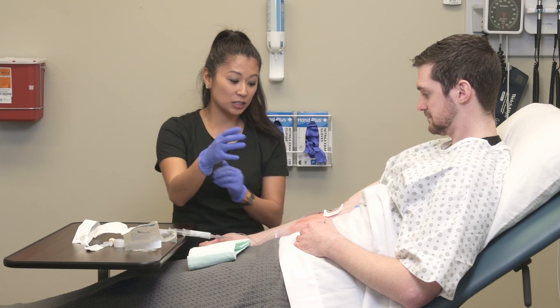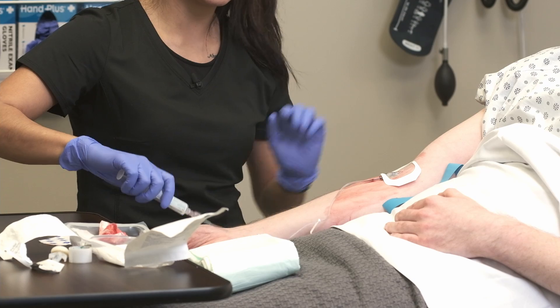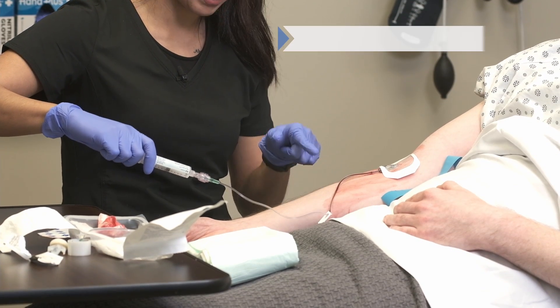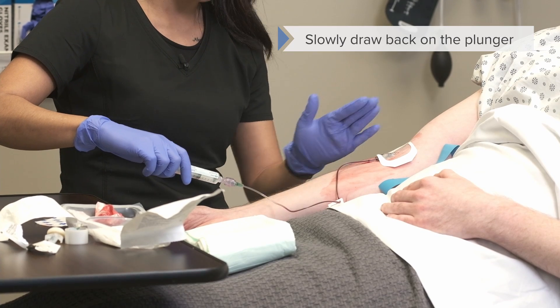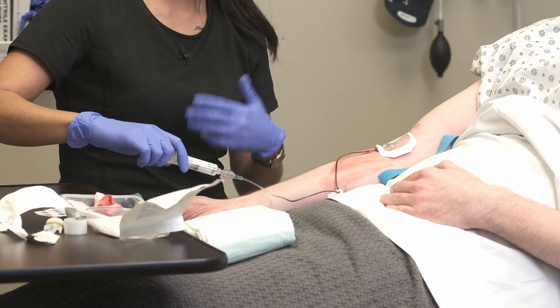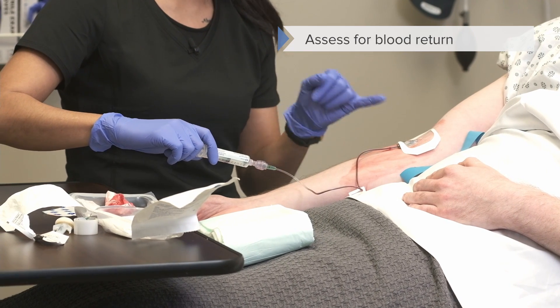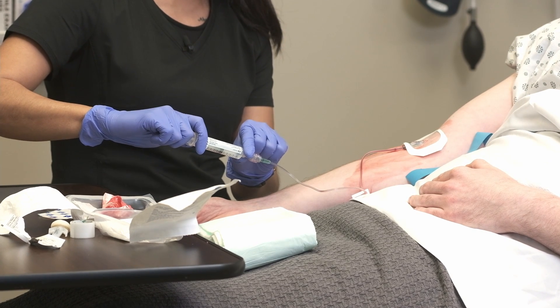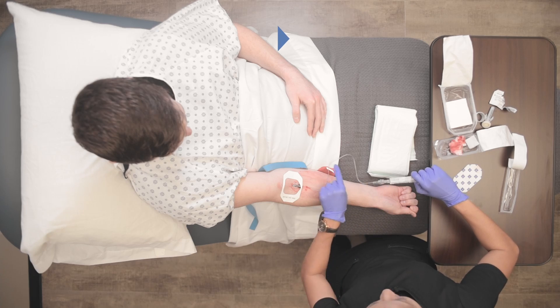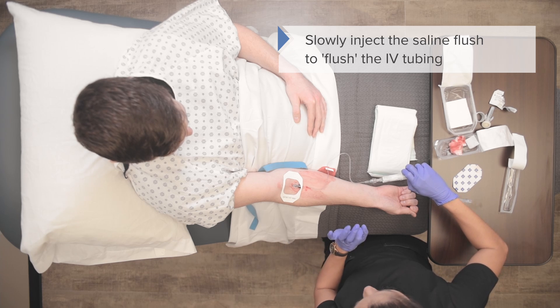Now that the transparent dressing is on, this is why I do this: so that the site is stabilized and I can pull back on this plunger slightly. You can see there's blood flow — I've got flash, or blood return, when I'm assessing to make sure I'm in the vein. And clearly, as you saw earlier, we're definitely in the vein. So I'm going to push this slowly and you can see how it clears up — there's the saline going in.